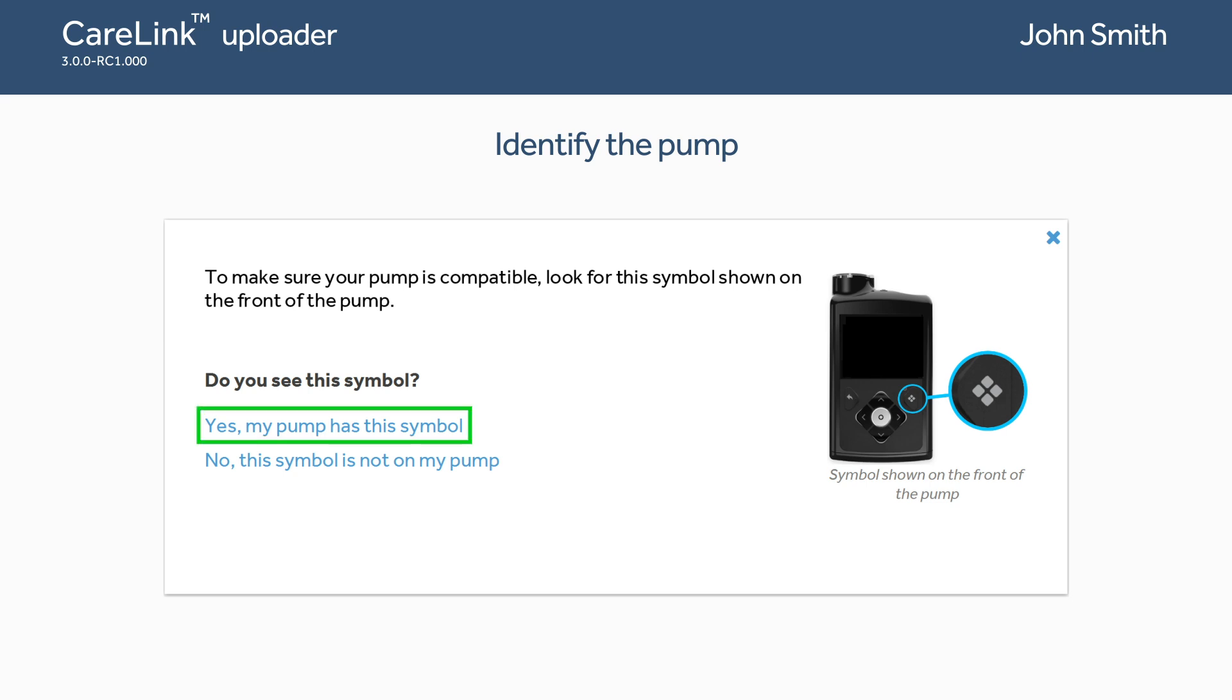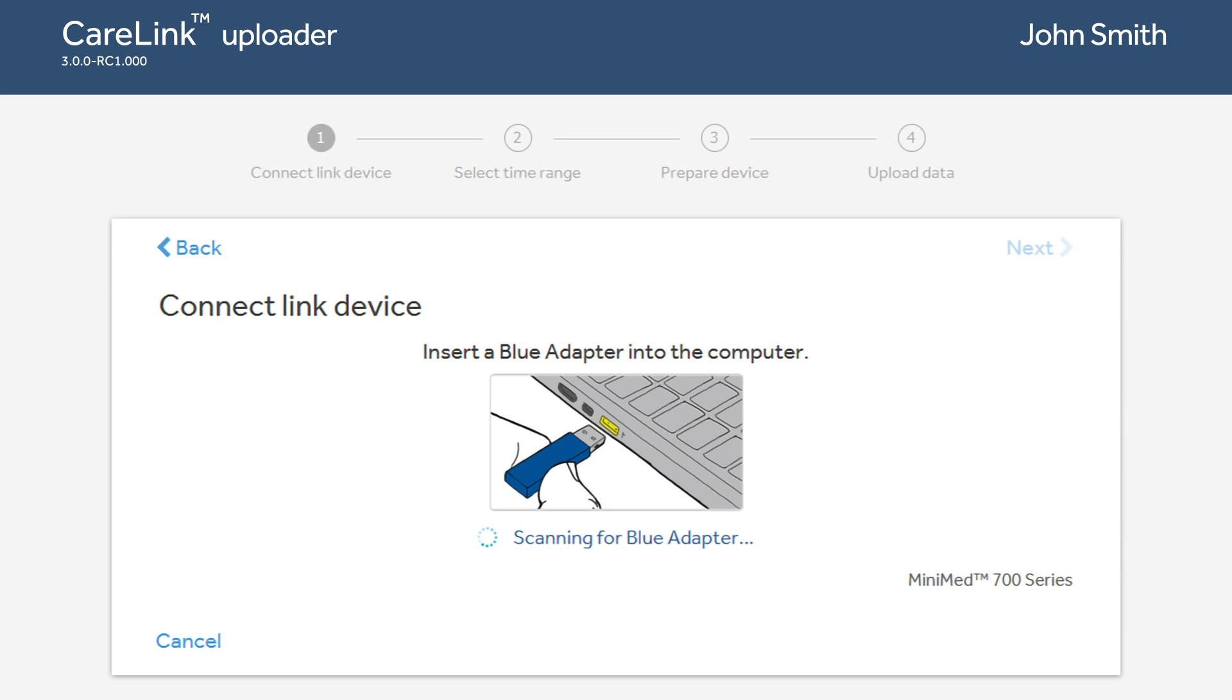Plug the blue adapter into your computer's USB port. The computer will scan for the device.